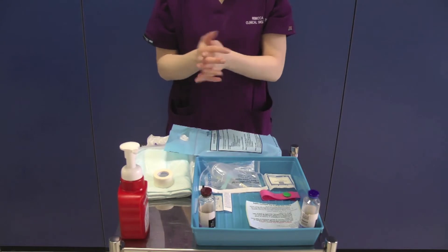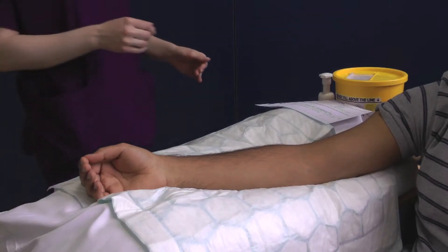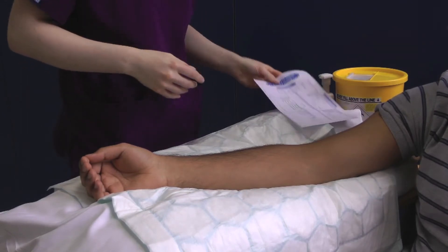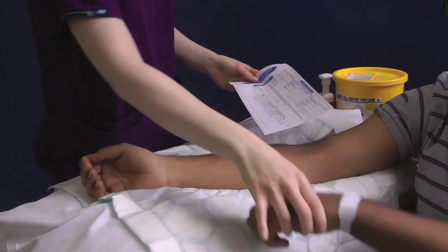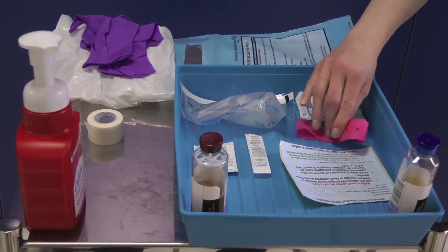Once you have done this, decontaminate your hands and proceed directly to your patient. At the patient's bedside, decontaminate your hands and reconfirm the patient's identity against the blood culture request form. Make sure that the patient is happy for you to proceed and position them so that they are comfortable, ensuring your equipment and sharps bin are within easy reach.